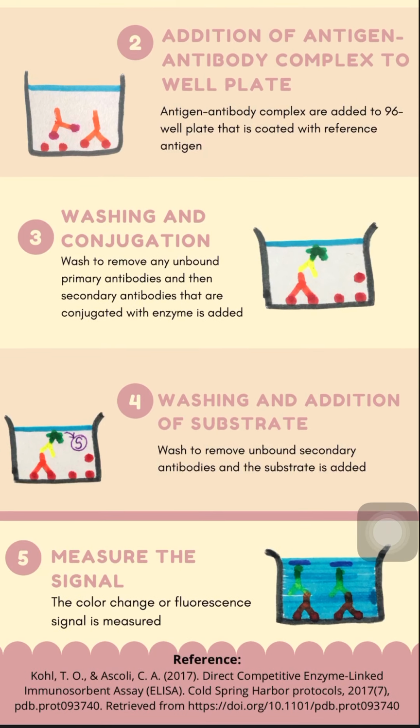Interpretation of the result would be as follows. Weak signals indicate that there is a higher concentration of antigens present in the patient sample, so less free antibody is able to bind to the reference antigens in the well and react with the substrate. Hence, it is vice versa.